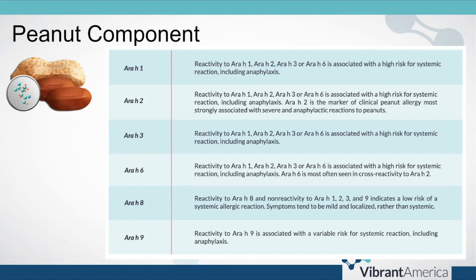This is actually going to look at the IgE reactivity of that patient, whereas the peanut zoomer is looking at only IgG and IgA as far as the individual proteins and peptides, and then IgE for the whole protein. If you remember again in Module 1 where we walked through the differences between whole protein testing and peptide testing, IgE antibodies to whole peanut would be completely different than individual antibodies to the proteins within whole peanut, which are what people are actually allergic to. So peanut component would be a nice complementary test in individuals suspected of having strong reaction to peanut.